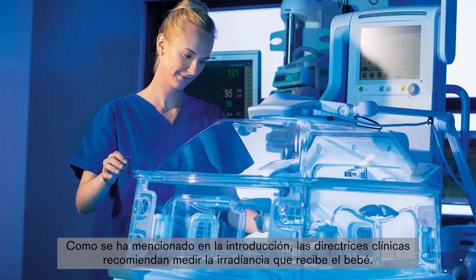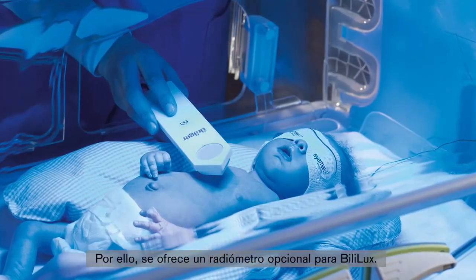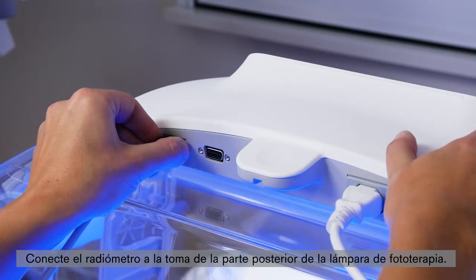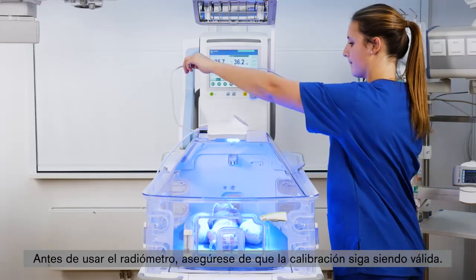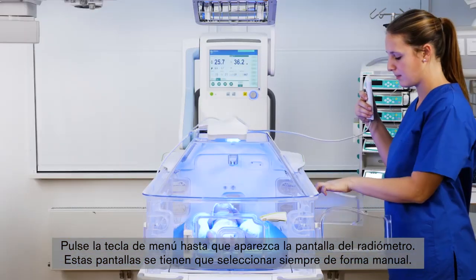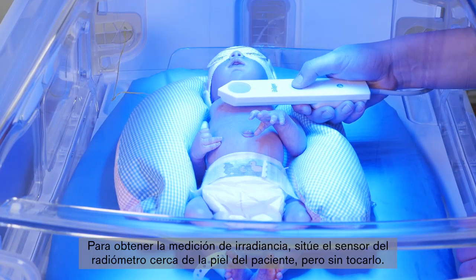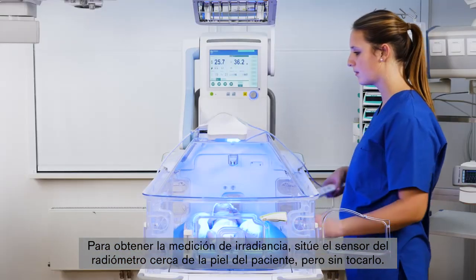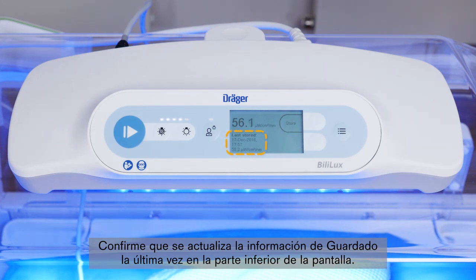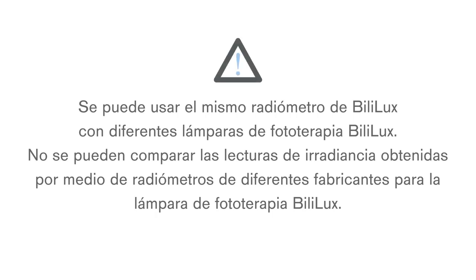As mentioned in the introduction, clinical guidelines recommend measuring the irradiance that the baby receives. Therefore, we offer a radiometer as an option for the Bililux. Plug the radiometer into the receptacle on the rear of the phototherapy light. Before using the radiometer, make sure that the calibration is still valid. Press the menu key until the radiometer screen is displayed — you always have to choose this screen manually. To obtain the irradiance measurement, position the radiometer sensor close to the patient's skin without touching the patient. To store the current irradiance measurement, press the store button on the radiometer or on the radiometer screen, and confirm that the last stored information at the bottom of the screen is updated. It is possible to use the same Bililux radiometer with different Bililux phototherapy lights. Irradiance readings obtained by different manufacturers' radiometers for the Bililux phototherapy light cannot be compared.